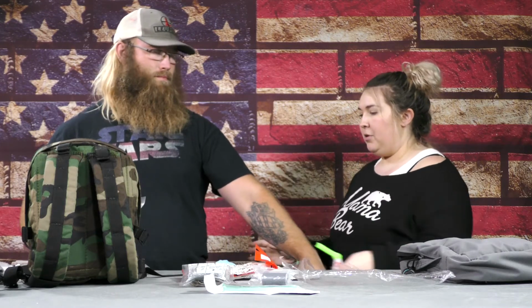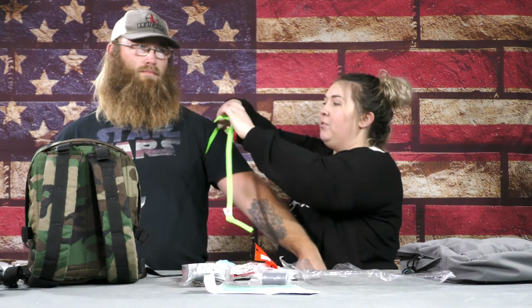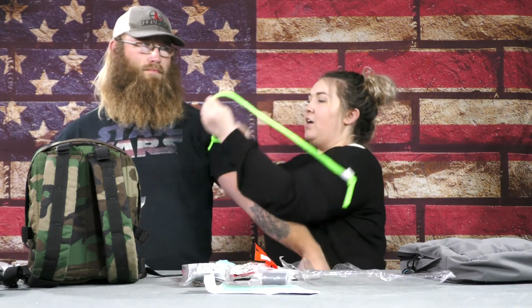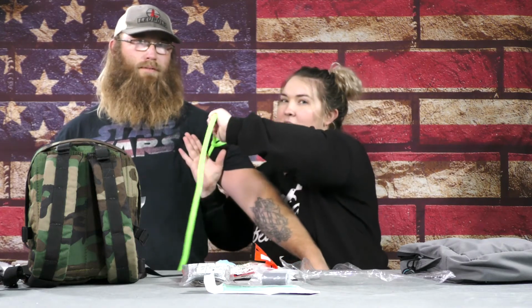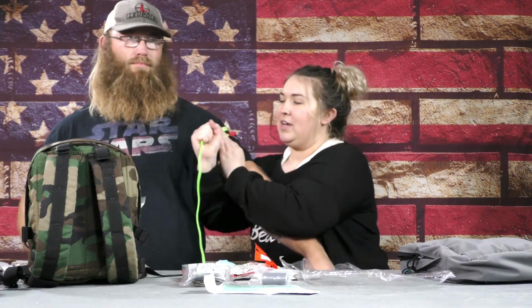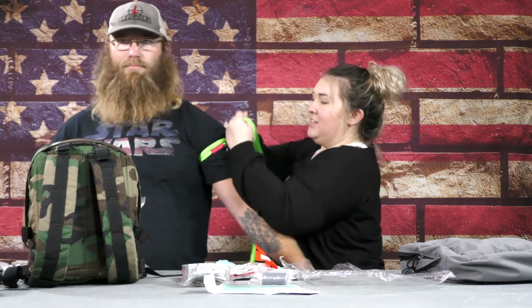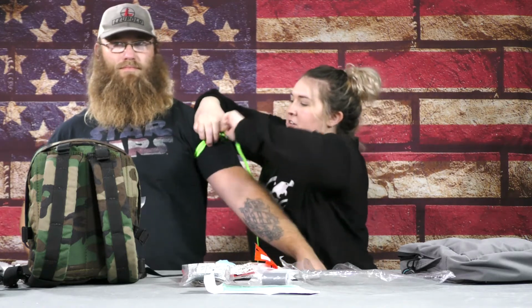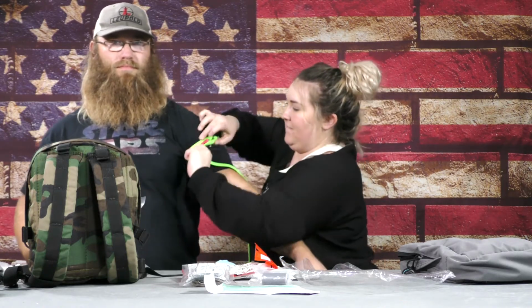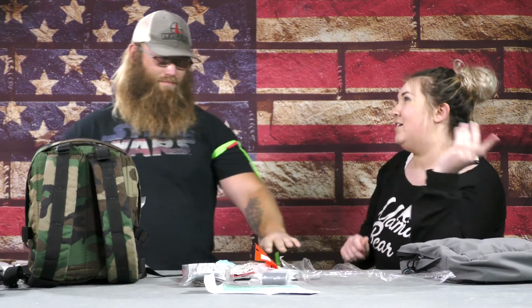The way that you put them on, you go up and then you grab right here, you pull it through and then go the opposite way. You can start applying tension to this immediately. So we're going high and tight. If I needed to, I could stop right here, and then you get it hooked in. It's a little bit more difficult. There we go.